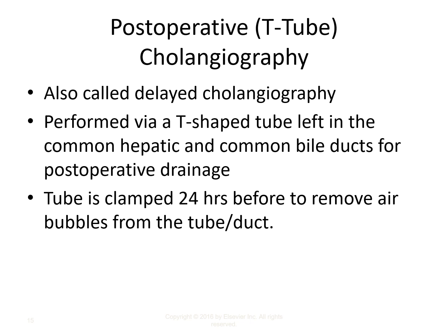Okay, we want to clamp the tube off 24 hours before to remove air bubbles from the tube or the duct pre-procedure. Because air bubbles could be introduced to the biliary canal via the small bowel, because this T-tube creates an additional exit route to the biliary system.